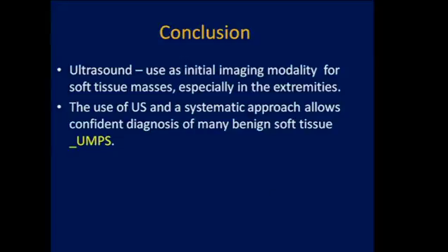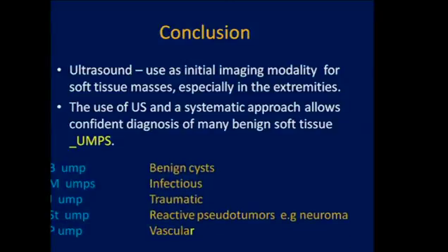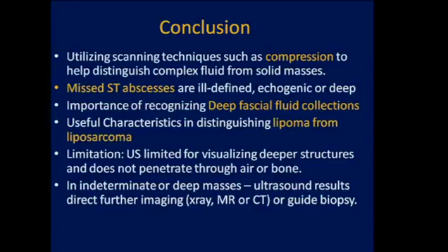In conclusion, ultrasound should be used as an initial imaging modality for soft tissue masses, especially in the extremities. The use of ultrasound and a systematic approach allows confident diagnosis of many benign soft tissue masses. And here we went through them, right? Here are the different etiologies. Major points: use compression techniques to distinguish complex fluid from solid masses. Don't miss soft tissue abscesses.